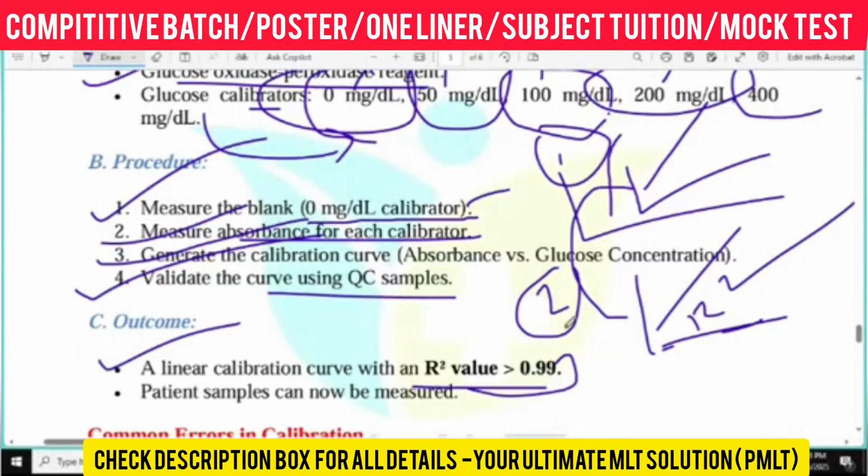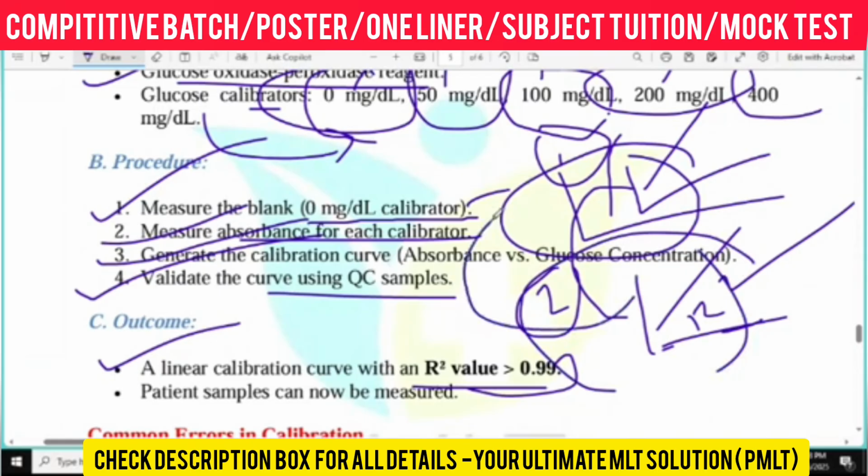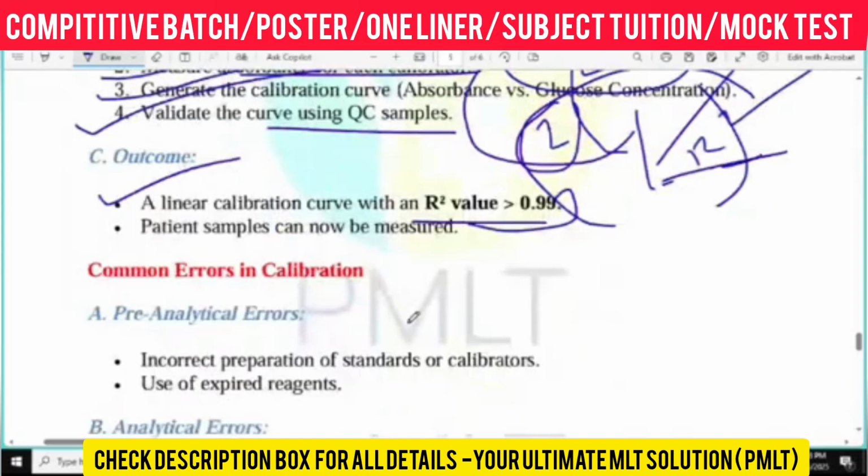First you get the calibrator curve, then the quality control curve, then you compare them so that you get the proper value. If the R square is higher than 0.99, then we can take the blood. Okay, the patient sample you can now measure.